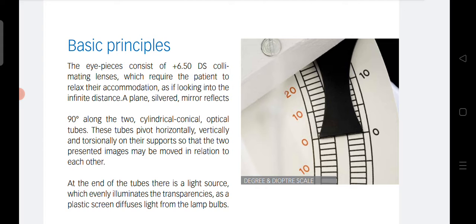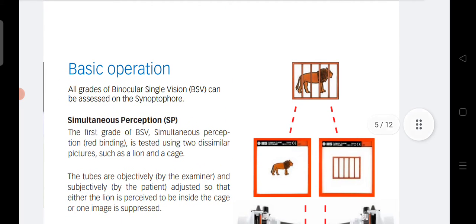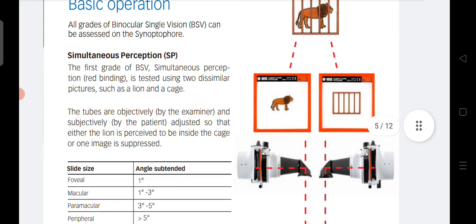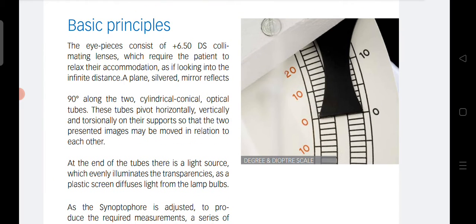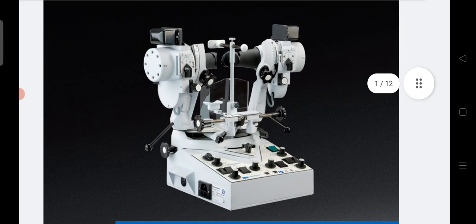You can also do the same test objectively. Put the slides and keep both arms at zero degrees, then ask the patient what he sees. If the lion is not inside the cage, you yourself move one arm — the left-hand arm — and bring the lion inside the cage. Whatever measurement you are getting — suppose 20 degrees or 10 degrees — that is your objective angle of deviation. So your first tasks in the synaptophore are: set the instrument, set the IPD, then measure the subjective and objective angle of deviation using the SMP slides. You can then find the angle of anomaly as well.